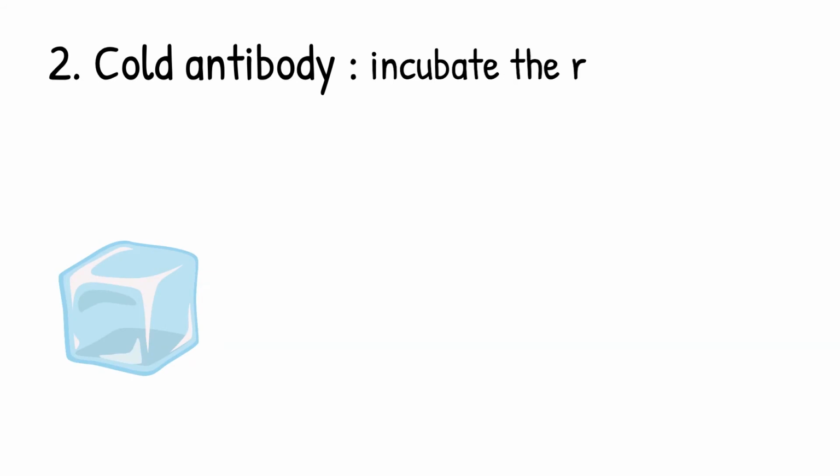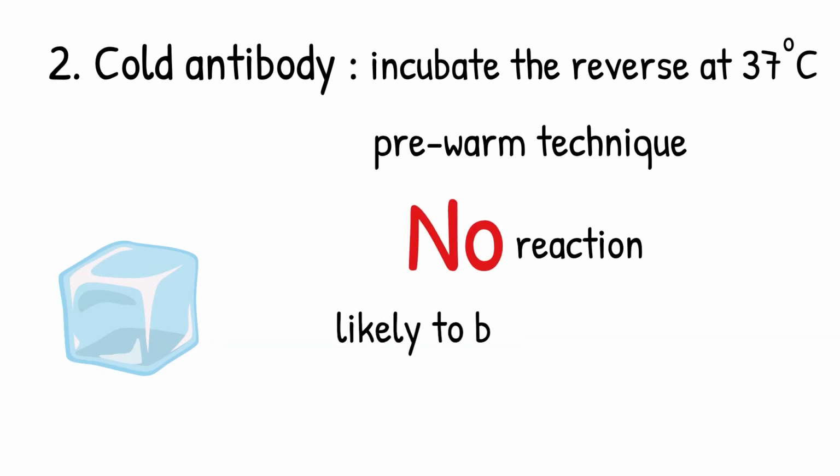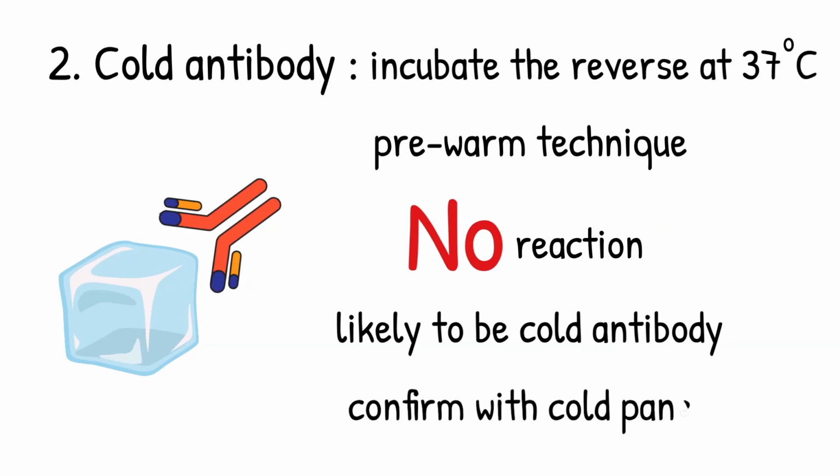For cold antibody, we can test these suspicions by incubating the reverse at 37 degrees Celsius or performing the test using a pre-warm technique. If the reaction disappears, then you are more likely to have a cold antibody, which can be confirmed by performing a cold panel.